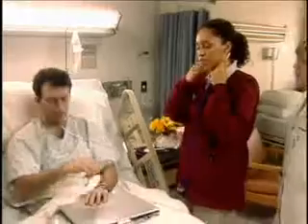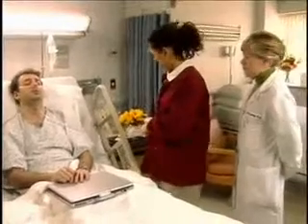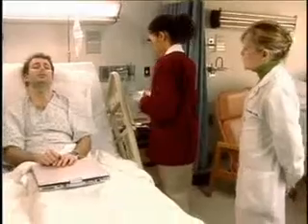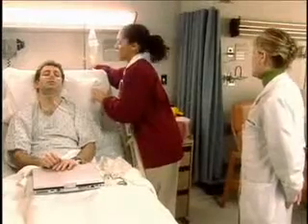Okay, Mr. Simon. We're going to get the face mask connected to the setup, okay? Okay, remove both flaps from the mask. All right. I'm just going to lay this right next to you.